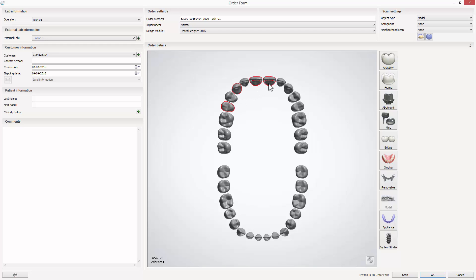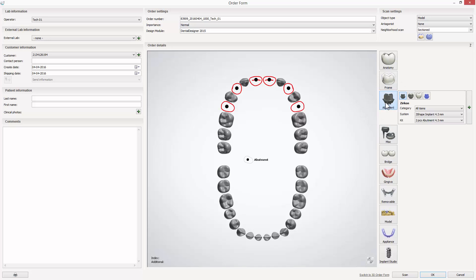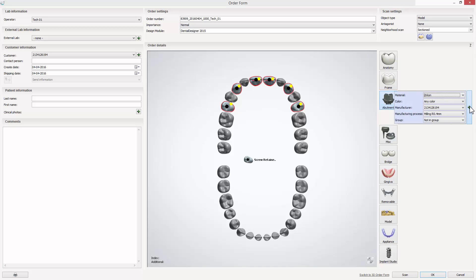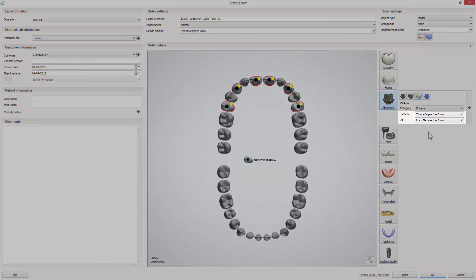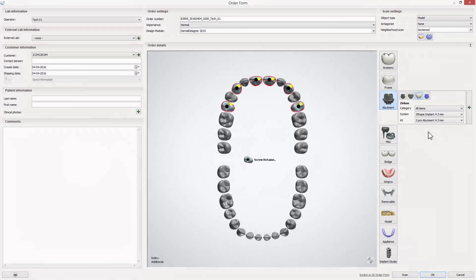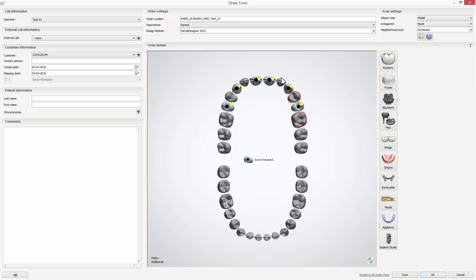Start with creating a new order. Mark the teeth you are going to work on and select a screw retained crown. Select zirconia as a material of choice if it is not default. Remember to choose the right type of implant system and kit. While scanning, always use a corresponding scan flag which must be screwed to the model.